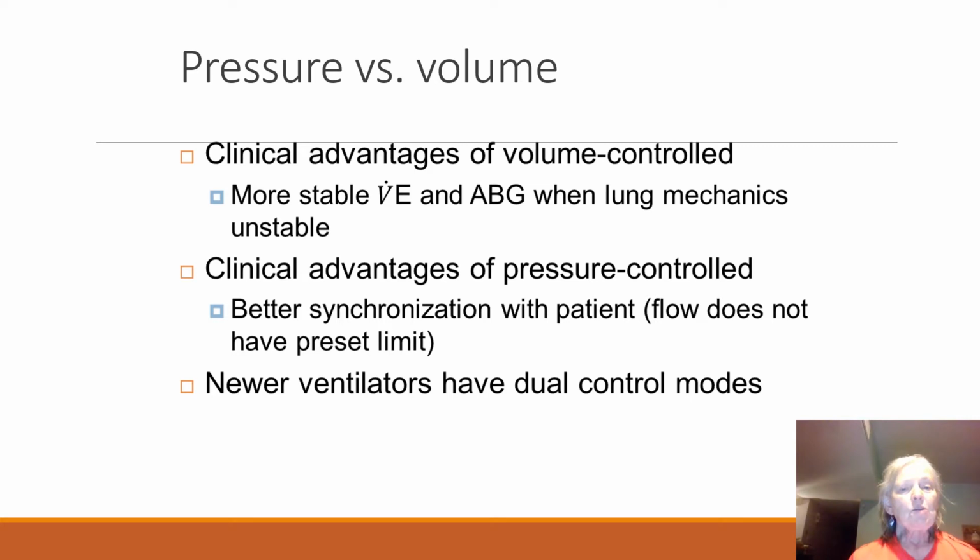So what's the difference between pressure and volume? And some machines actually have both of these. Some of these you may set a pressure ventilation, but you have a volume assured. You may have a volume ventilation, you have something going on with the pressure also.